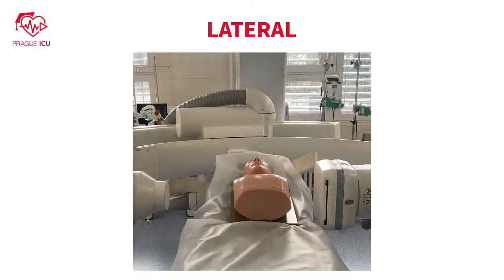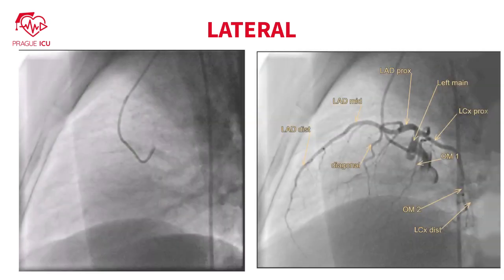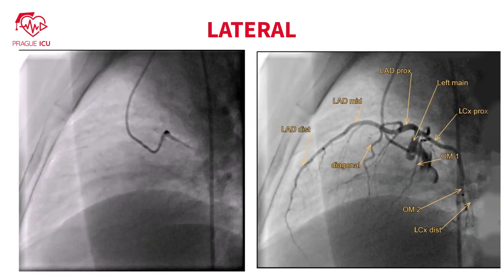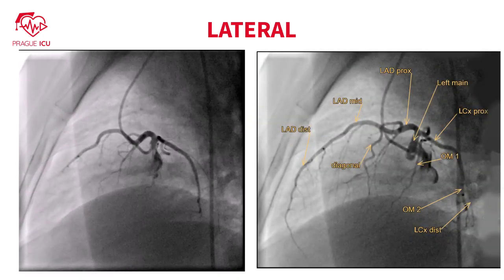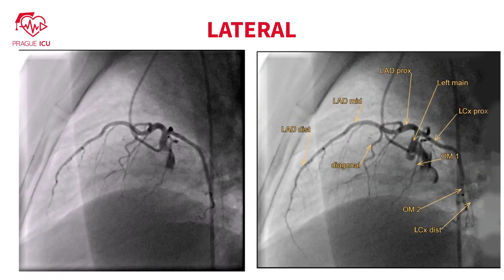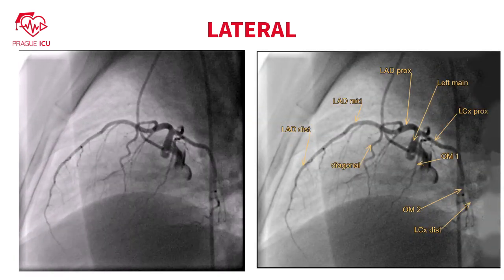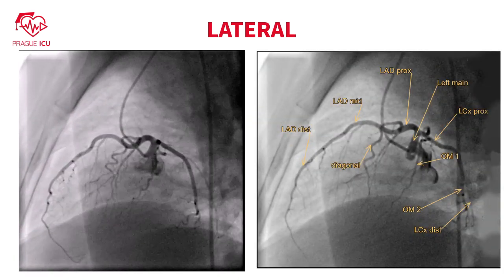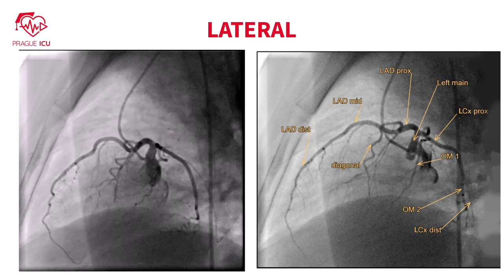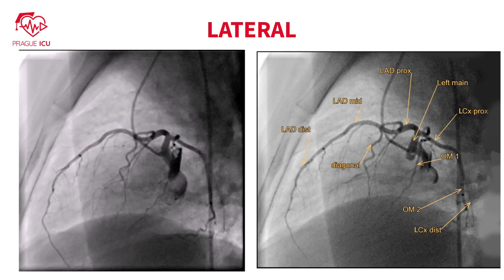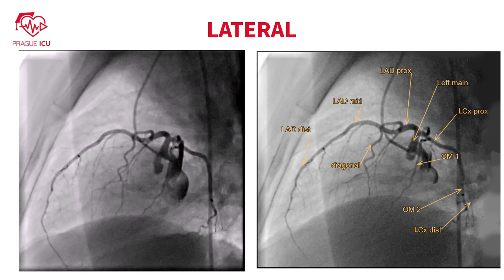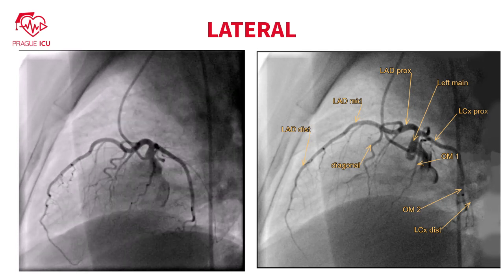Lateral, left anterior oblique 90 degrees view shows the mid LAD and the circumflex artery. Especially surgeons like this view for possible visualization of intramyocardial courses of the LAD.